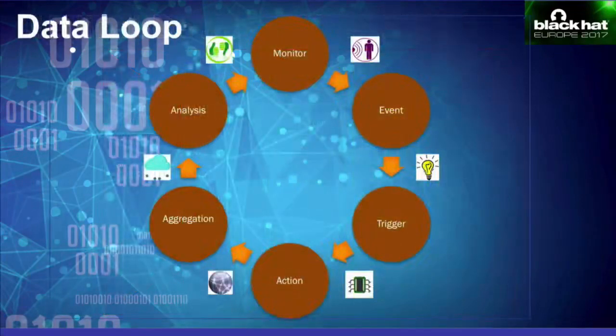When I was doing this research, from my perspective, this is what an information loop of a typical medical IoT device looks like. I'll explain it with the example of a simple insulin pump. At rest, the device is always in a monitoring mode, so it monitors, for example, your insulin level, your blood pressure, etc., using sensors.